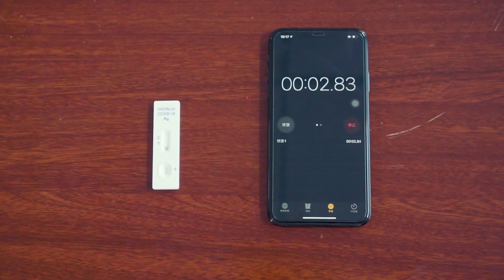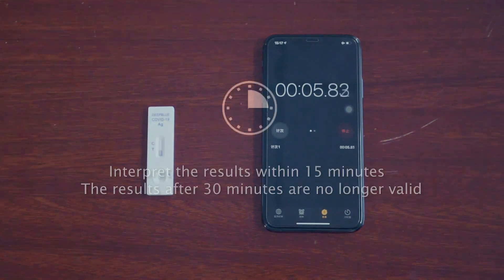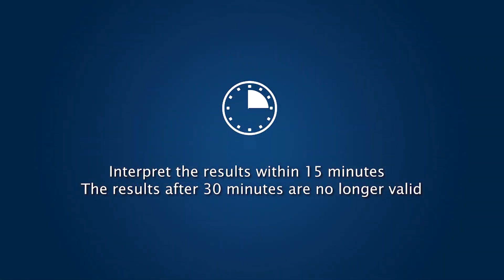Start the timer. Interpret the results within 15 minutes. Results after 30 minutes are no longer valid.